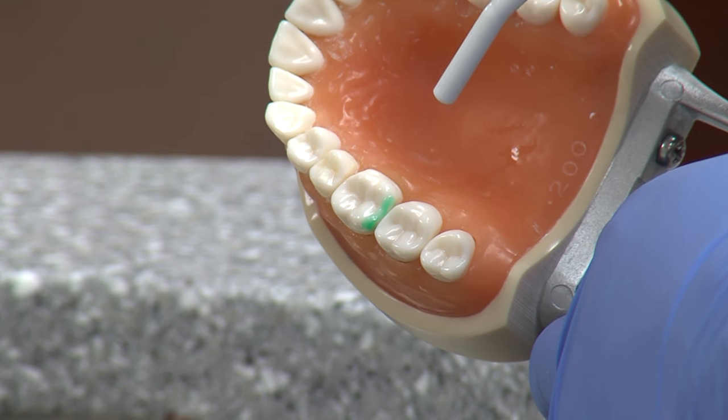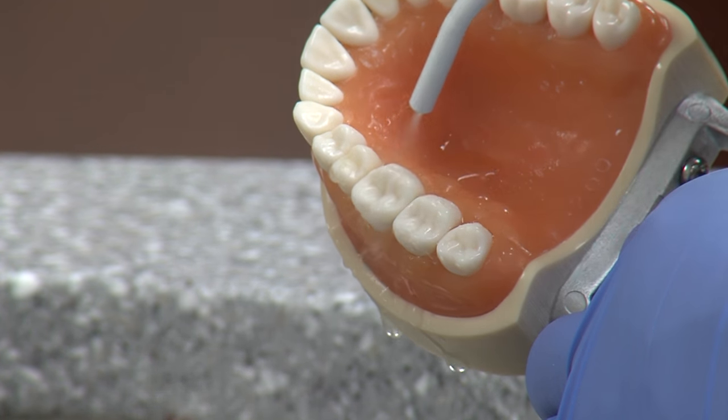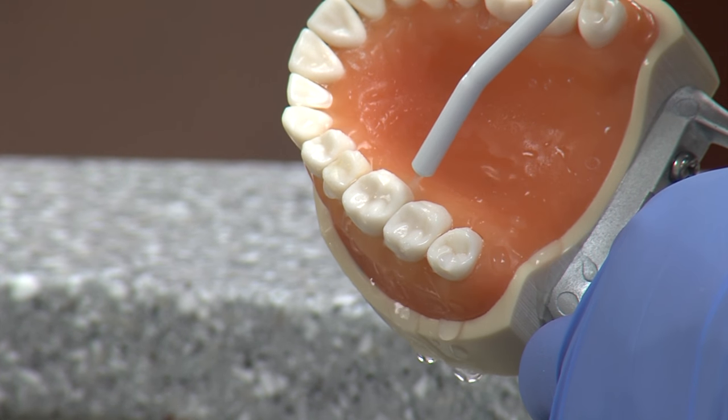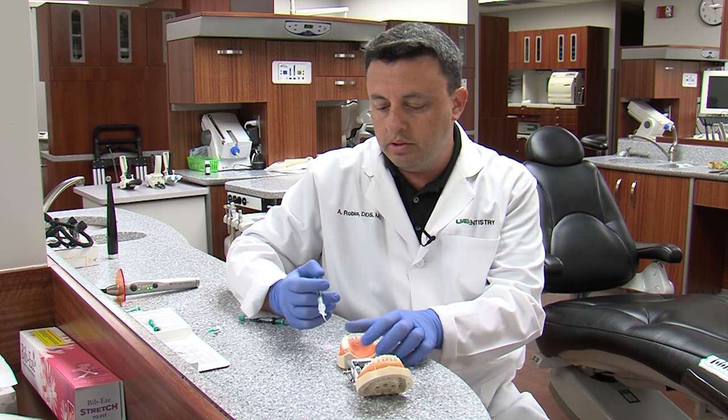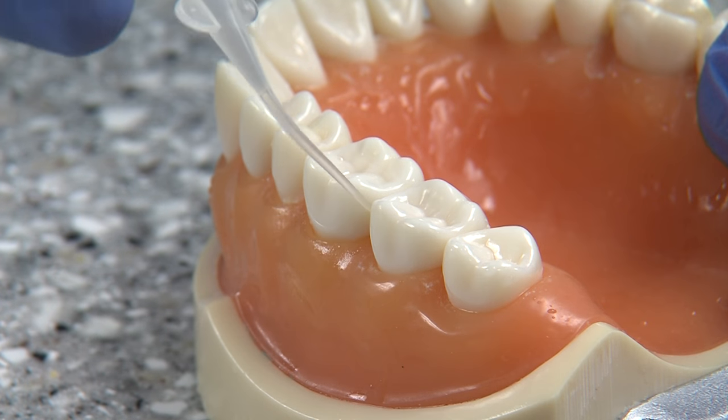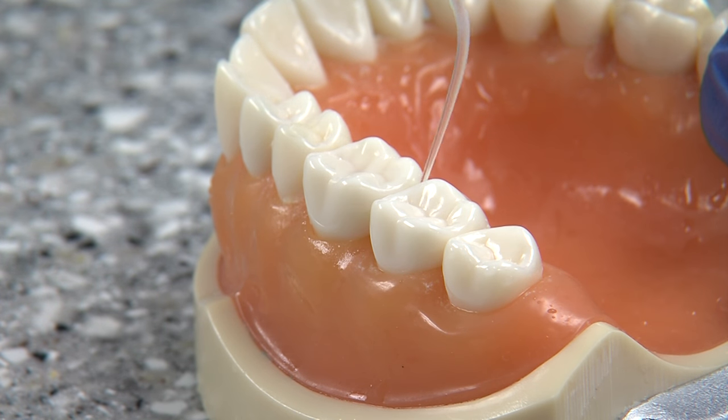After two minutes of application, we'll remove this and rinse it really, really well. After rinsing, we would use a solution that contains alcohol that helps dry the surface really, really well.